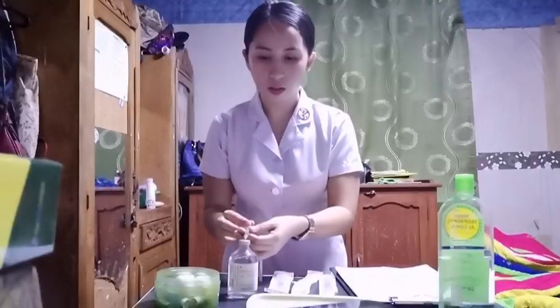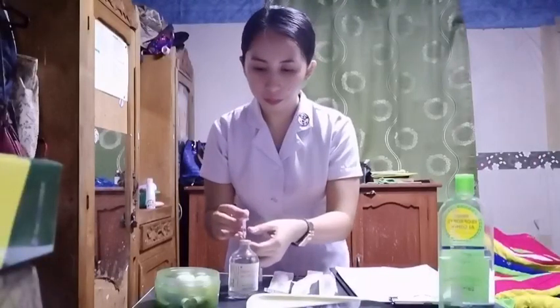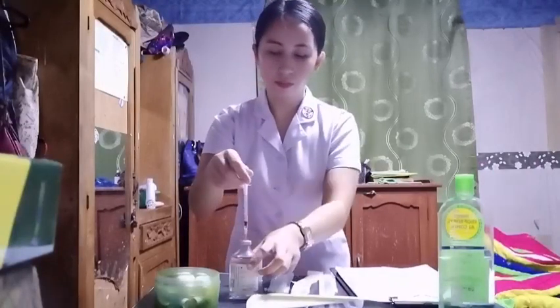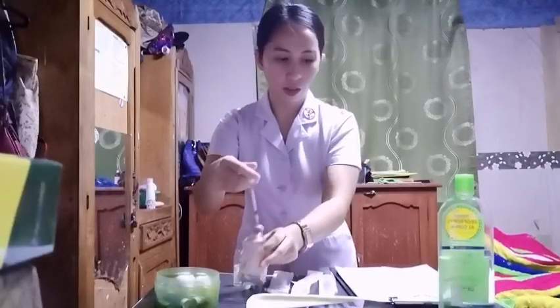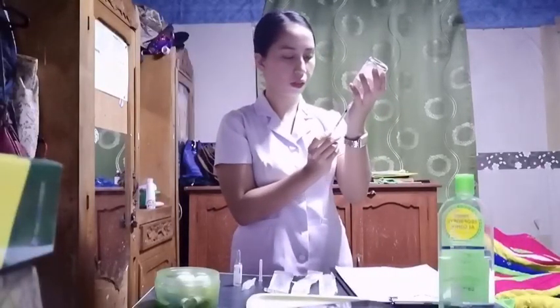Then inject the air into the vial. And then invert the vial and draw the medication up to the exact amount needed.